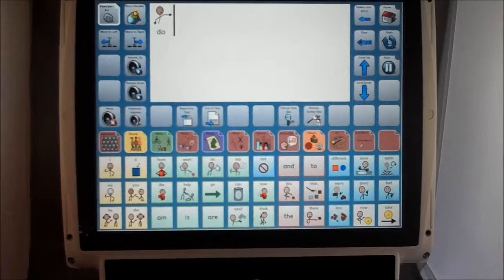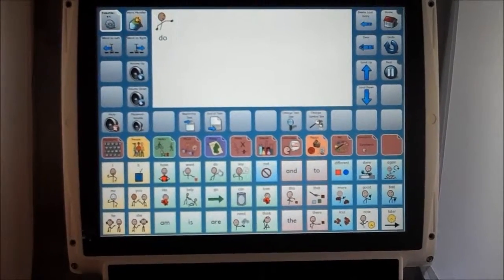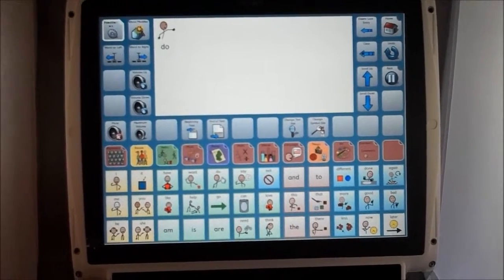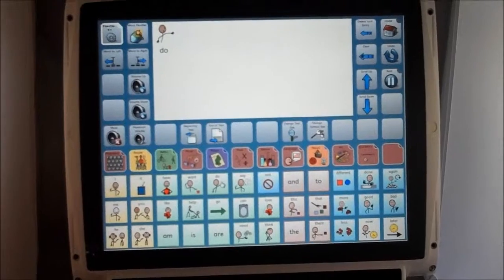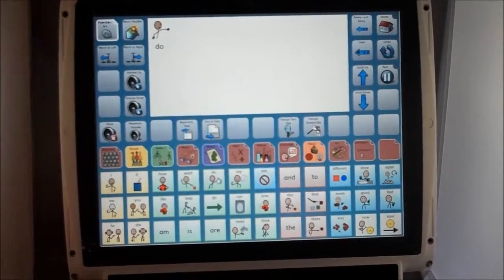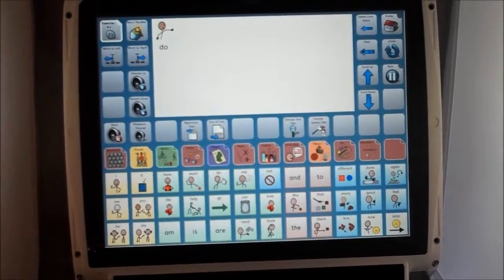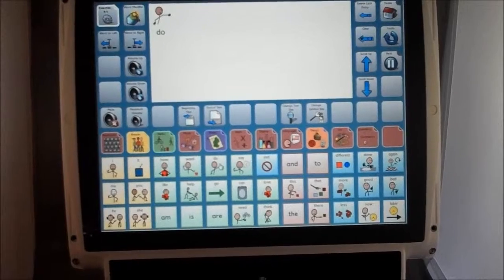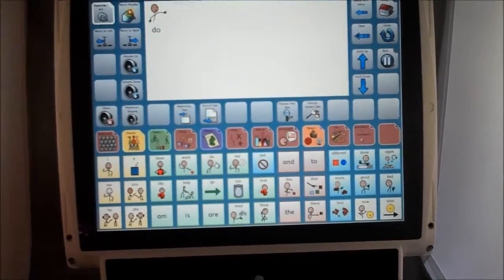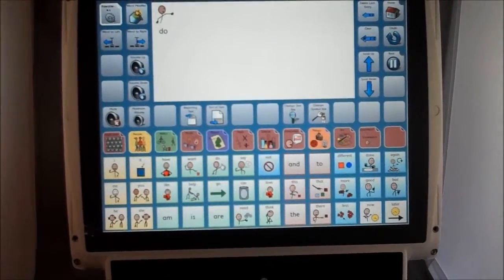Can't use it when it's raining. It's a computer. Can't use it in the bathtub. This mounts very well to Jay's wheelchair, but when Jay is out of the wheelchair, mounting can be a little bit trickier, and we don't have a great solution on that. So in times when the high-tech AT is not possible, we need to go with an alternative, and we have a couple of low and no tech options. Let me share with you one of our no tech options.